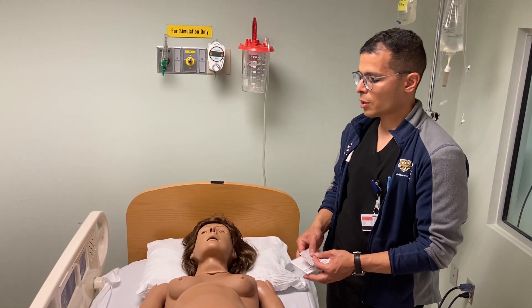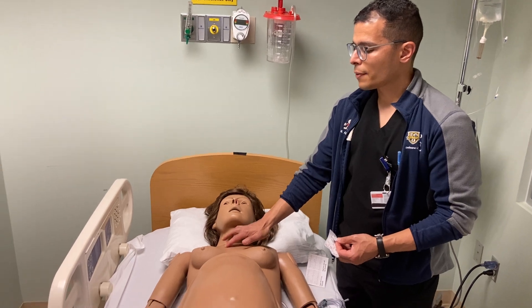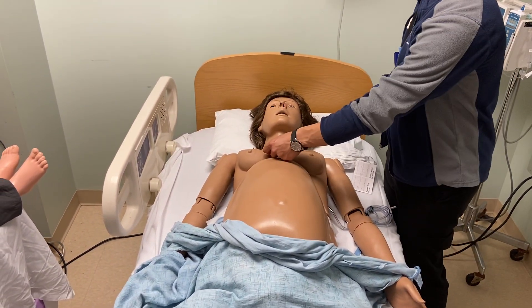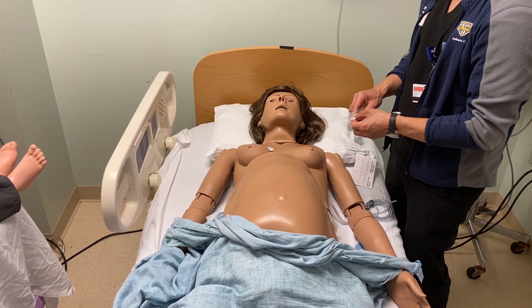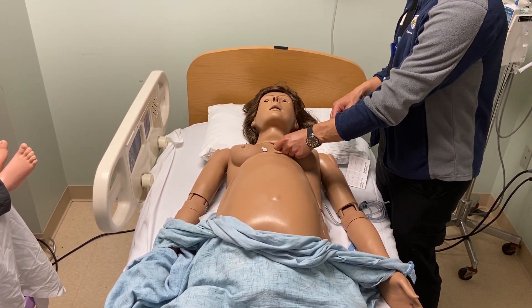The principles are the same. We'll find the fourth intercostal space for our patient, and for V1 we'll place it just to the right of the sternal border in the fourth intercostal space. For V2, we'll place it similarly just to the left of the sternal border in the fourth intercostal space.